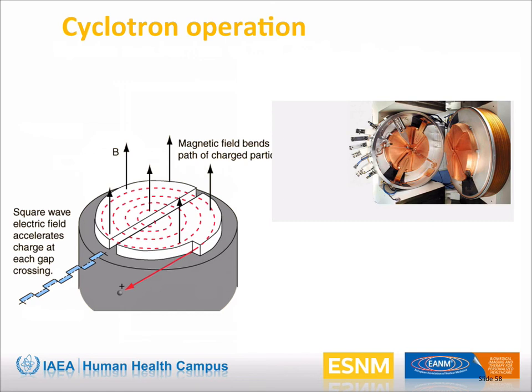The resulting H+ particle is directed to the fluorine-18 target filled with O18 water. The protons produced by the cyclotron collide with the O18 nuclei to form fluorine-18. After irradiation, the resulting radionuclides are released from the target to the hot cell in the laboratory. Several hundreds of gigabecquerel fluorine-18 can be produced.